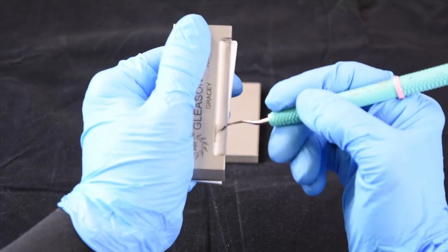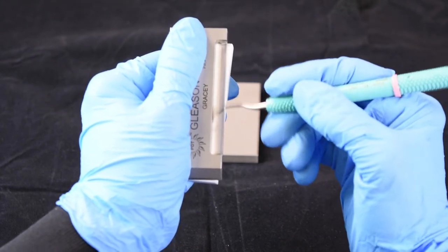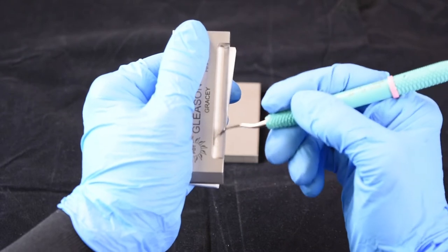Using a pendulum motion, we have heel, toe, heel, toe.